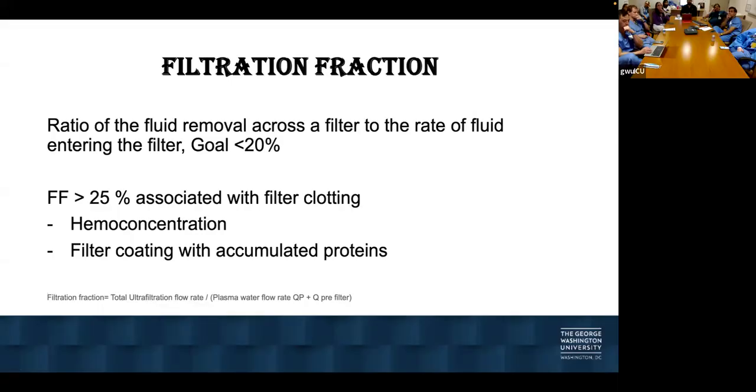Sometimes I get asked, let's just do hemodialysis for this patient before we send them to the floor, making sure that they are able to tolerate hemodialysis. It's a very valid request, but you are moving from one replacement fluid to another, which means losing time or losing the circuit and getting another person to do it. So it's a lot of cost with that.